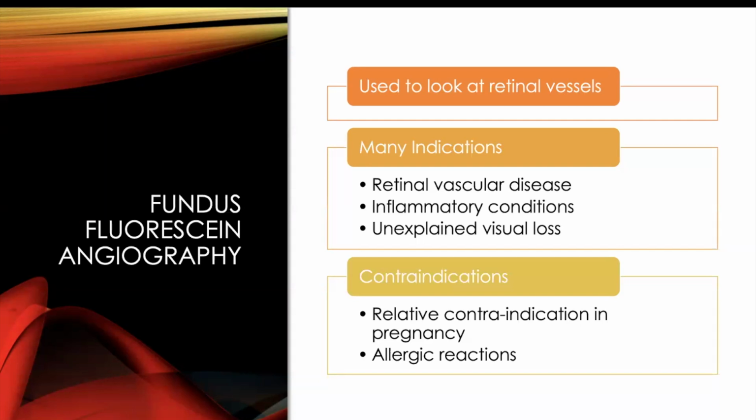CNVs, inflammatory conditions, very similar to sort of your white dot syndromes, posterior uveitis, and any sort of unexplained visual loss where you've not got anything on a clinical exam and you're wondering what might be happening on a vascular level at the retina. There are certain relative contraindications.